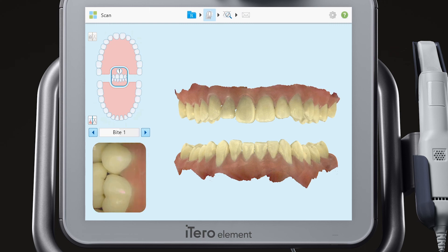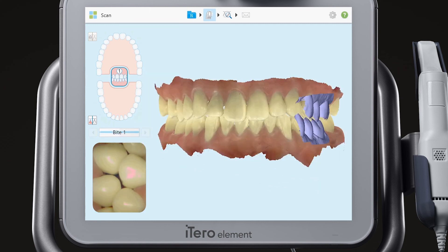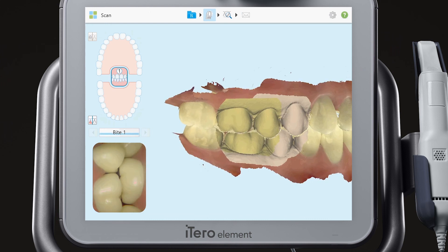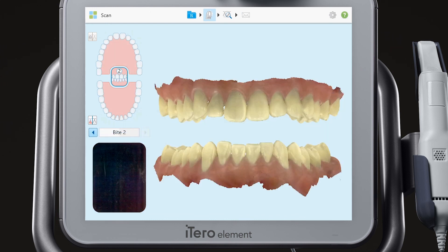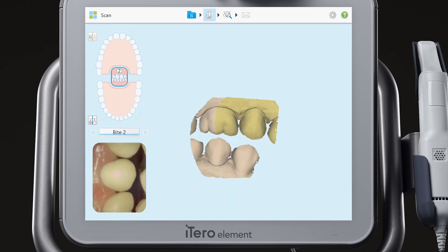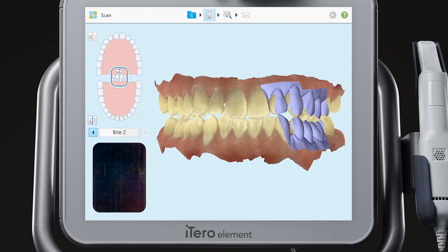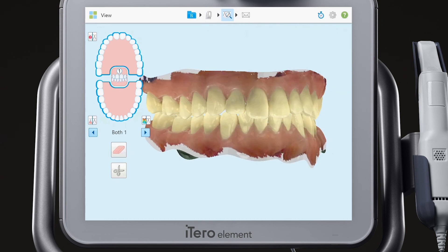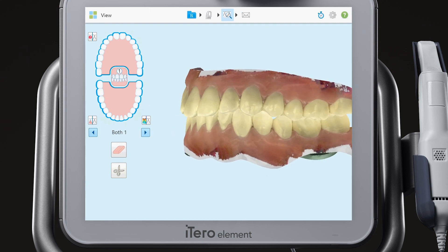In the bite segment, capture the first bite in the desired occlusion. Move to the second bite and capture another bite in a different occlusion. Review the models and send the case.